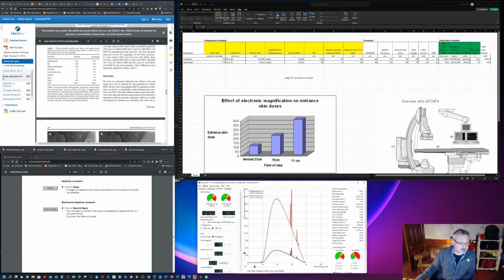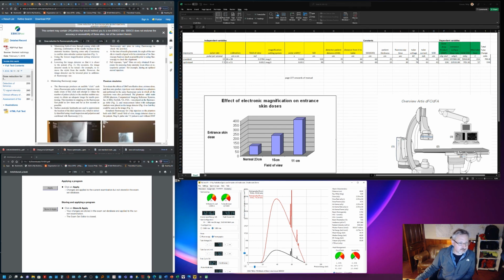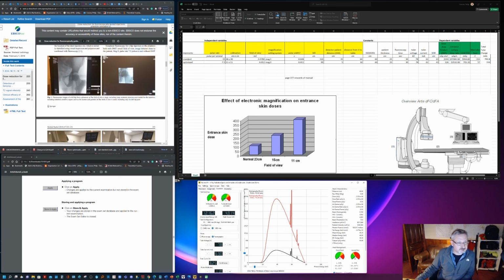They seem to be able to carry on and do quite a lot of these injections without any complaint. Yeah, so this was one picture and this is another, and you can tell this is a bit smaller, obviously, difficult to see, and grainy as well a little bit, maybe, in my imagination, I don't know. But they were willing to accept this, and that's the point about optimization, isn't it? As long as it's diagnostic, then you should be willing to accept it.